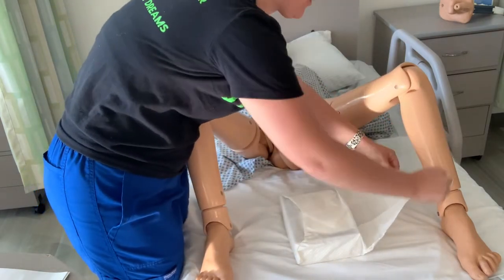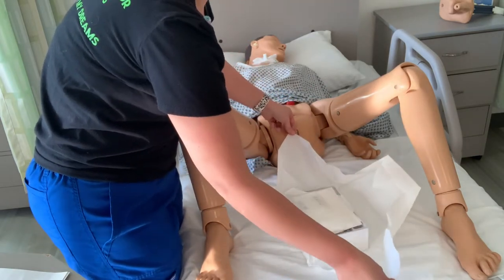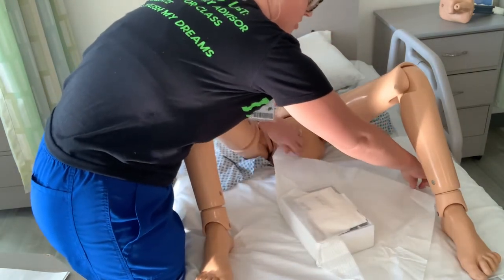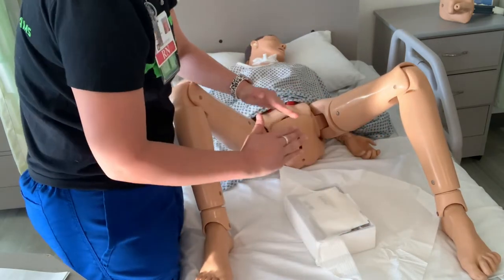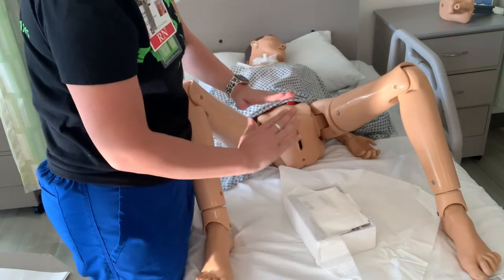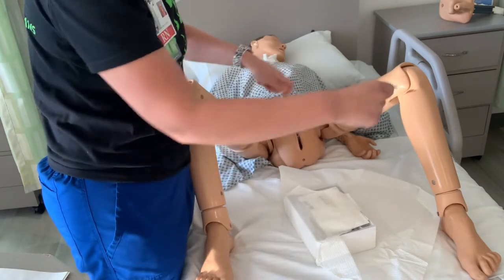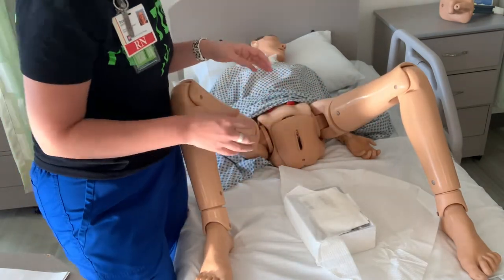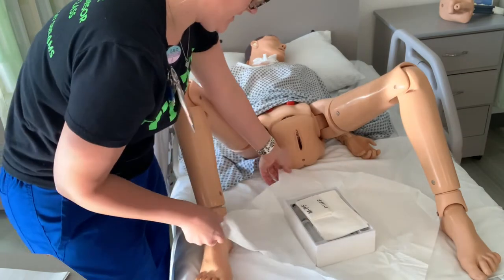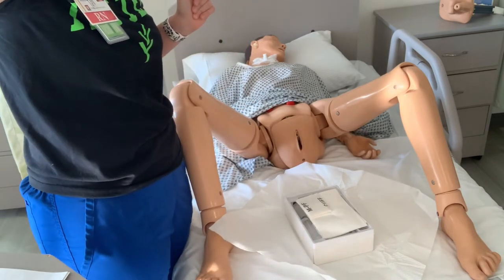Open these two sides here — this is sometimes difficult keeping the flaps out. This is an important step to make sure you are not having these corners and flaps flopping back onto the sterile field after you've already touched the corners, because even if you've touched that one-inch margin with your sterile gloves, if it flops back over, now you've contaminated. Pulling the sides in different directions is going to help you get that out well. Lastly, open the spot towards you — maneuvering how you pull is the best way to do that. You can always touch the outer one-inch margin safely.